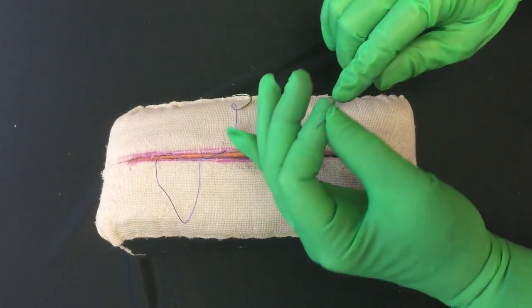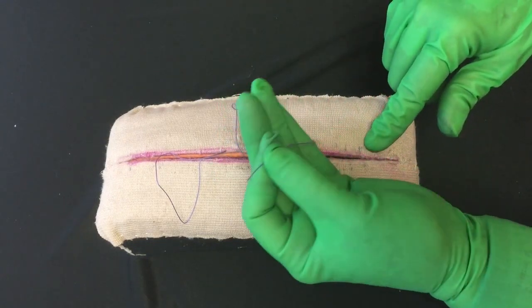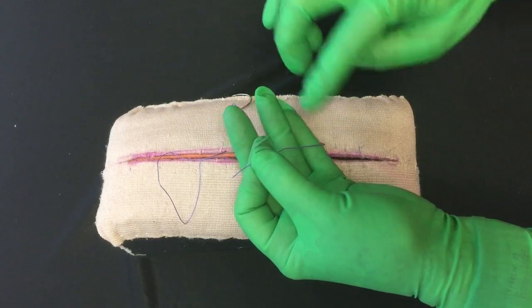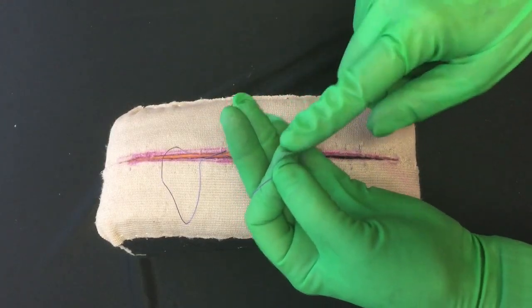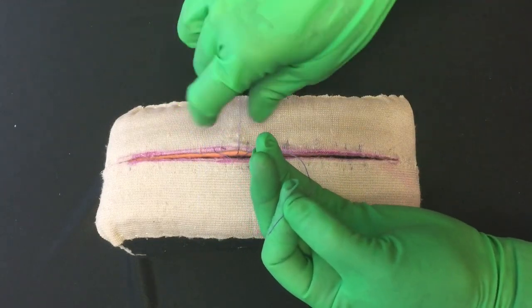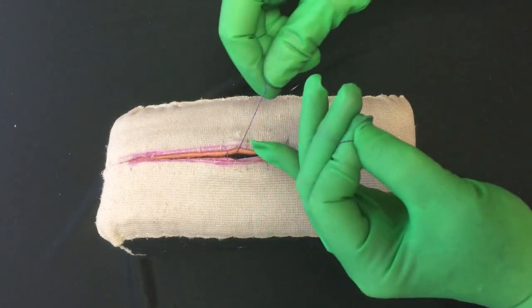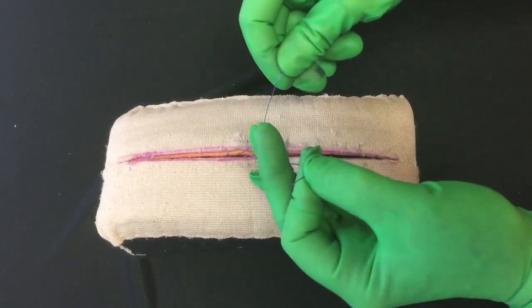If you can't remember that, which a lot of the residents and students that I teach find confusing, you can lay it across your palm just as long as it's in this direction. Then I want to use my little finger and these two fingers to give it some tension. I take this hand and I crab walk out the excess. You want to tie up in the air, not down here where you're going to be fighting the patient's body.